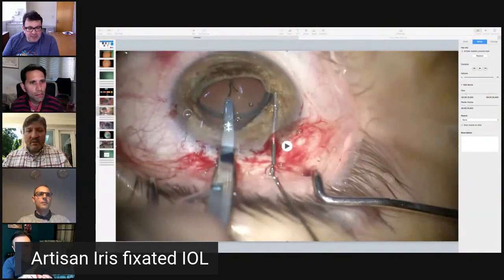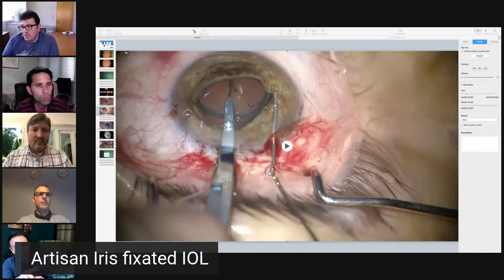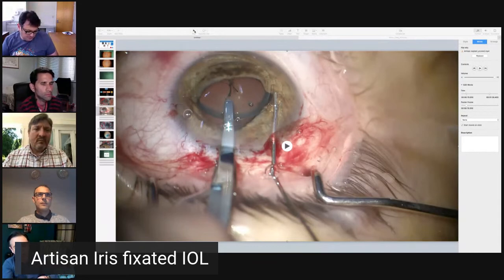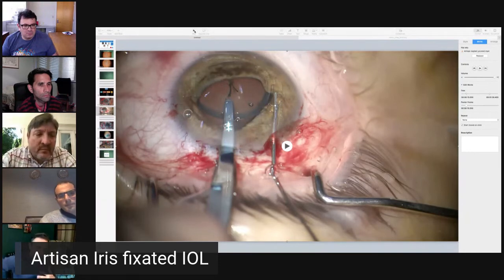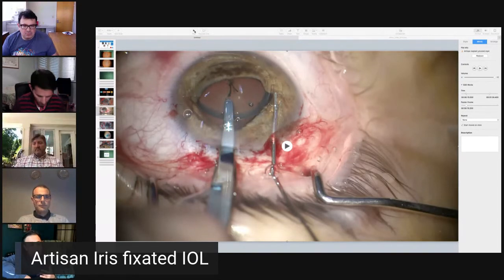One thing, Ahmed, while you put the video on, can I just say that one of the things that put me back from using these lenses in the anterior chamber nowadays is that these lenses were designed to clip with a lens behind, so you had a very stable iris diaphragm. Once you remove that lens from behind in an aphakic scenario, it's what Aman mentioned before. I worry about how much wobbling there is backwards and forwards, and I don't know the long-run impact in a young patient. That's why I'm happier putting it behind.